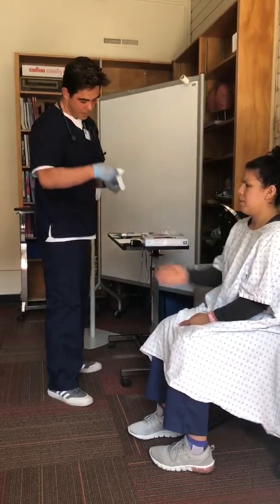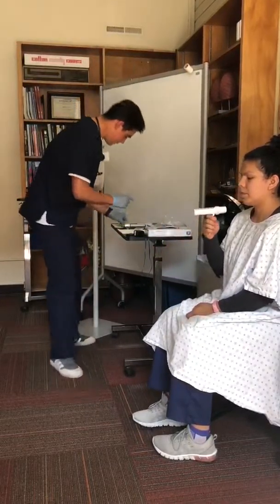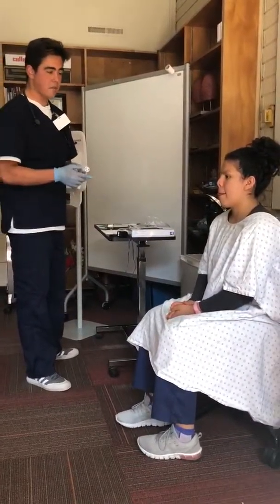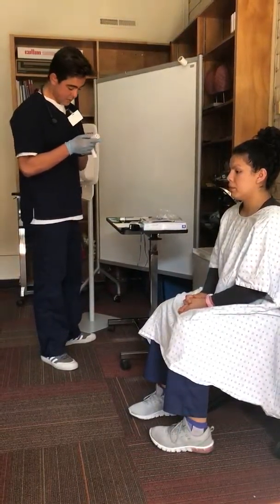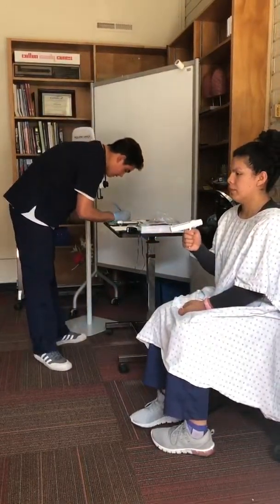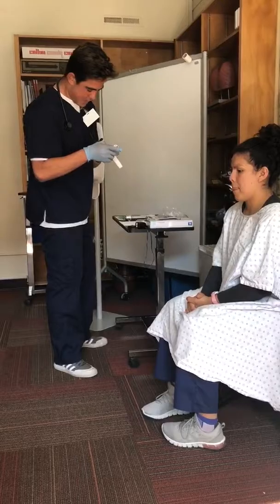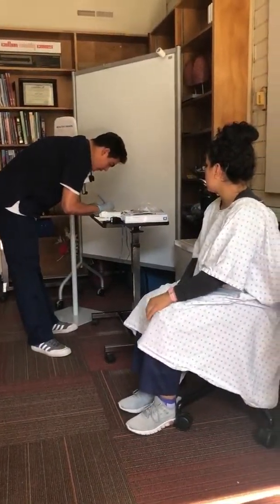Okay, good job. First one is 190. We're going to reset that. Okay, good job. Noting the patient's effort, so good effort right now, having a little bit of difficulty due to the asthma exacerbation. So we're at 170. Reset that. Okay. And 170. Okay. Thank you very much. So we have 190, 170, 170.